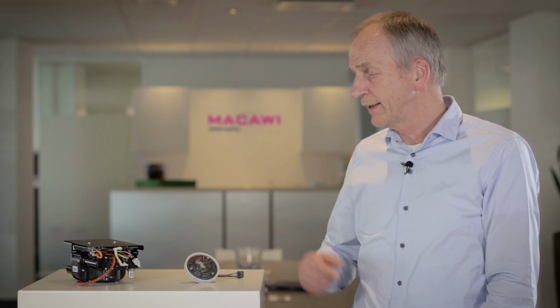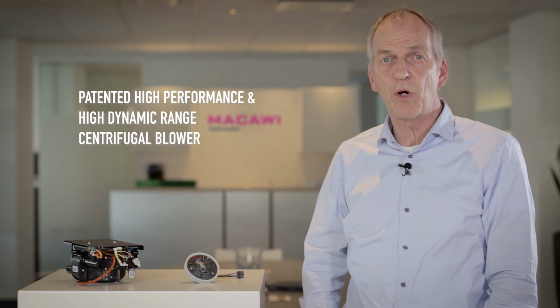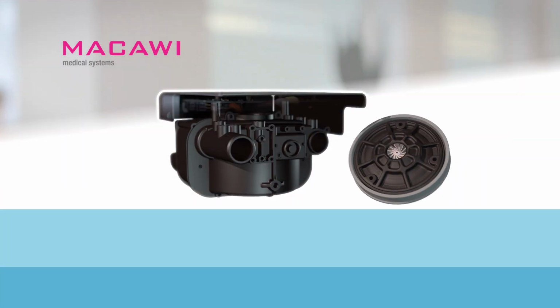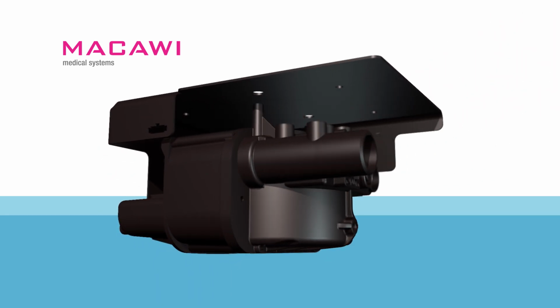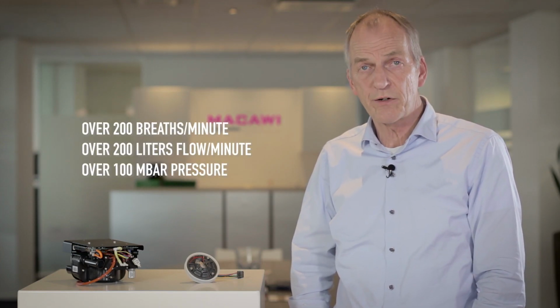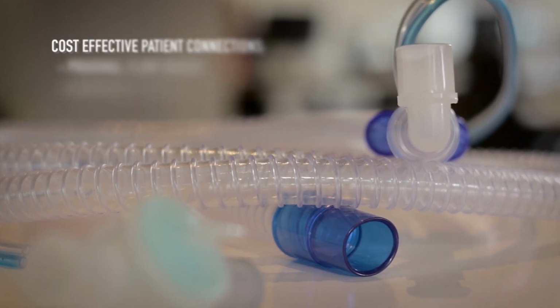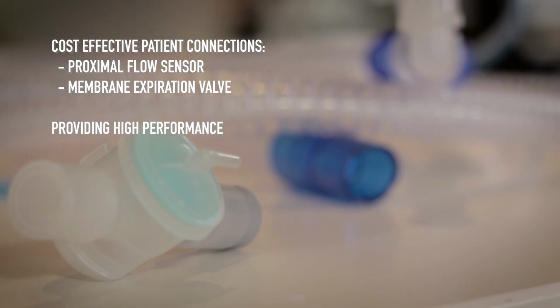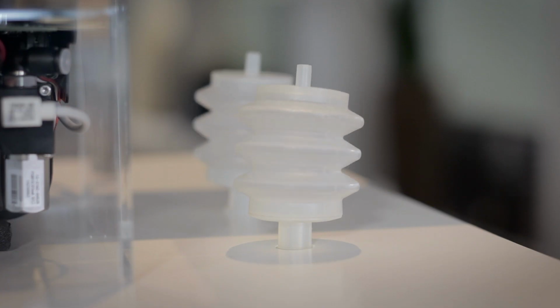The ventilator module is designed around this centrifugal blower, which is very dynamic. With this high dynamic behavior, we can ventilate up to 200 breaths per minute and deliver over 200 liters per minute flow and over 100 millibars pressure at sea level. For the patient connection, we have chosen to use a standard proximal flow sensor and a standard membrane expiration valve, which are cheap but can deliver you high performance.